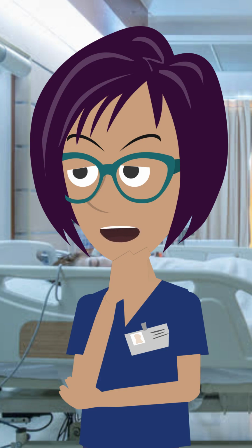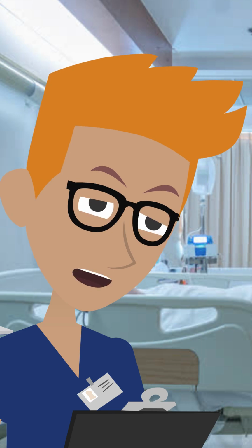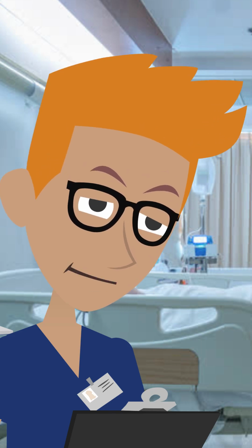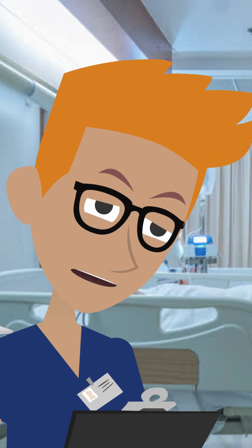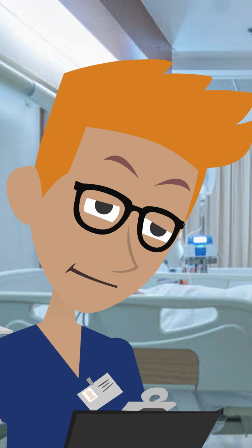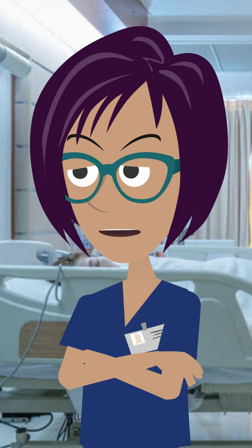Is the chest drain on suction? Yes, it has to remain on low suction. That's between 3 and 5 kilopascals until it's reviewed by the respiratory doctors. Right. I've put a transparent dressing around the catheter insertion site, so it's easy to check for infection or bleeding. I've also taped the tube connections so they are secure. Great. Thanks. I'll keep an eye on it.